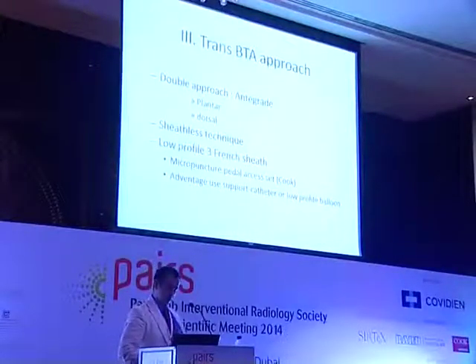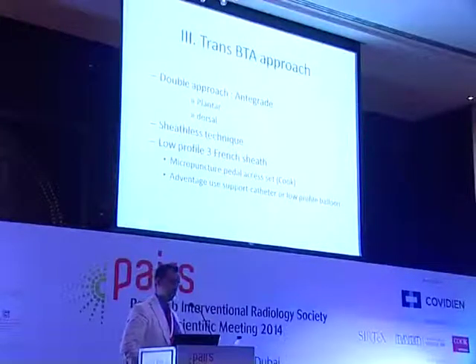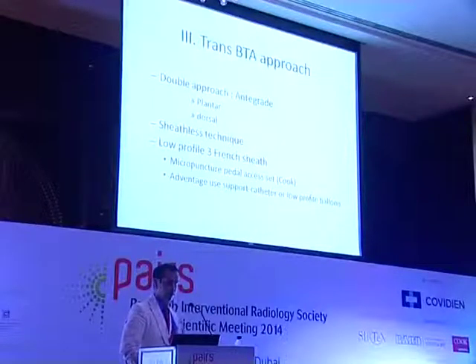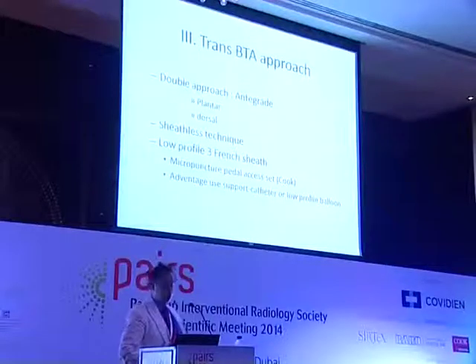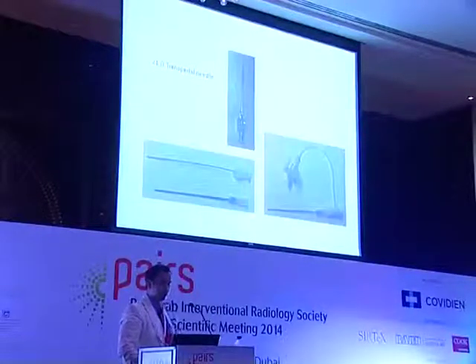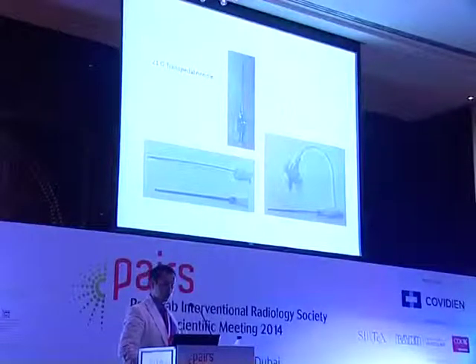For the below the ankle approach, in the down part of the limb, in the pedal approach, you can use the plantar or the dorsal artery. It's a sheathless technique, or also with a low profile 3 French sheath from Cook. Here are the tools we have, with this 21 gauge needle to puncture the artery.